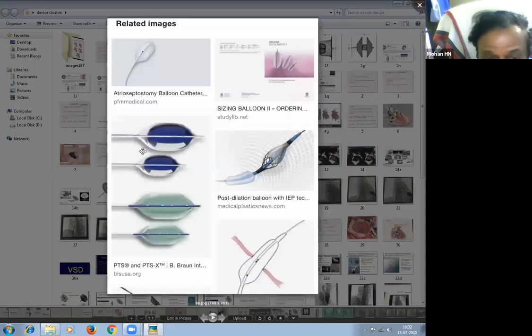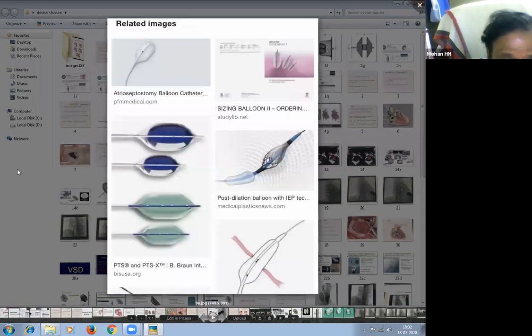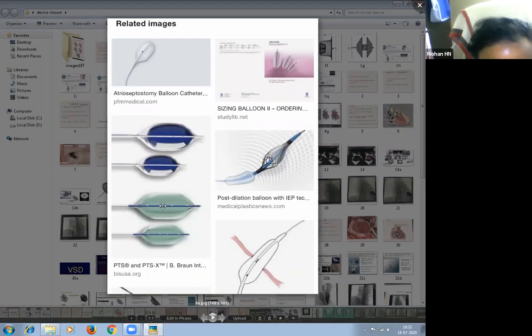What we will do is the computer will ask what length. We will mark 10 millimeter here, select it as 10 millimeter, and drag the line from here to here. This is the 10 millimeter. Then we will click calibrate, and it will take a reference of 10 millimeter here.